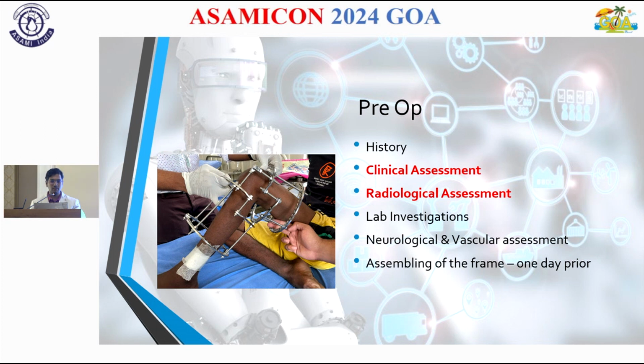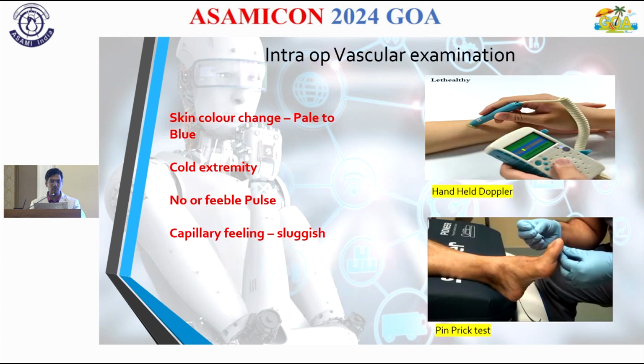The preoperative assessment starts from history. Clinical assessment and radiological assessment are of paramount importance for any case for a successful outcome, and neurological and vascular assessment and documentation is a must. The assembly of the frame I try to do mostly 1 day prior to reduce the time.